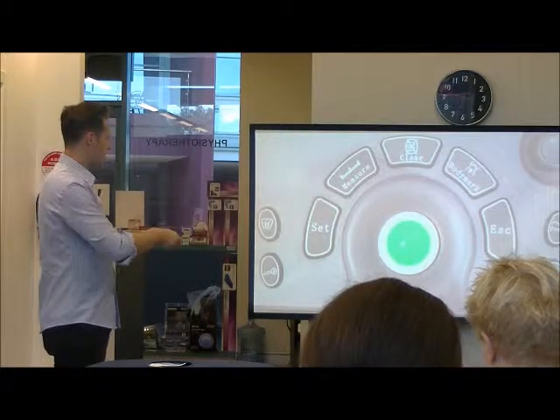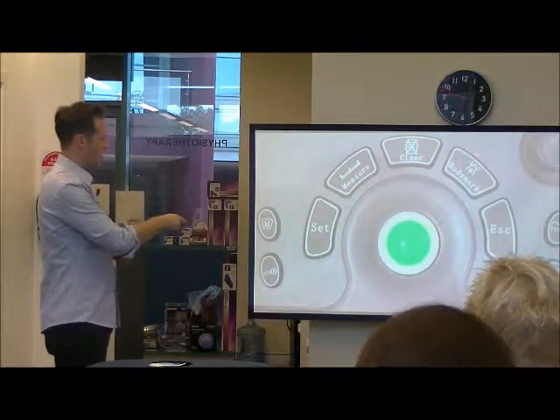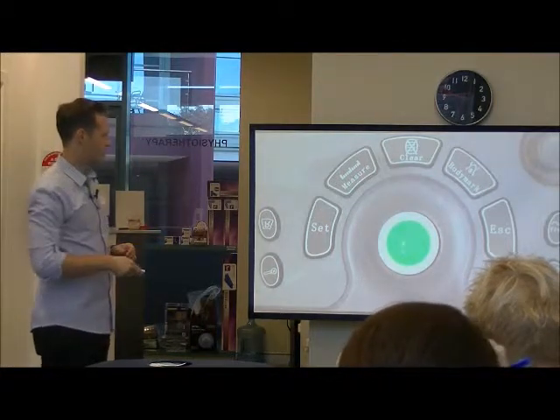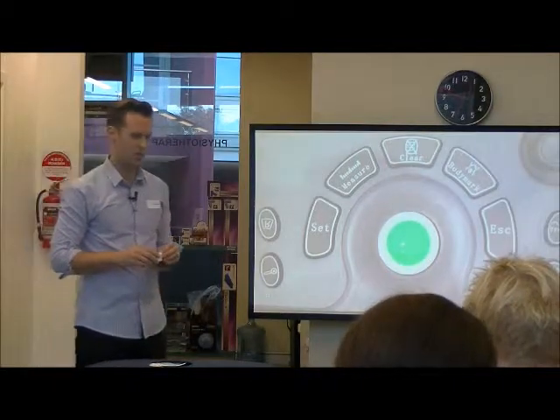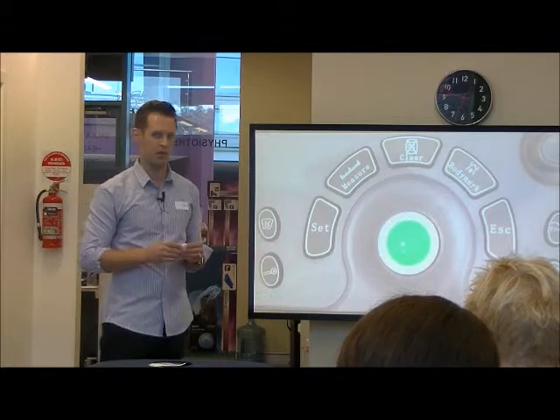Down here we've got our trackball, measure button, clear button. If again you really want to, and we'll do this in a practical in a moment, if you really want to have a look and save these images to your patient files, it is worth putting a body mark on the image so you can standardise where you have your probe and what part of the patient's body you were looking at.